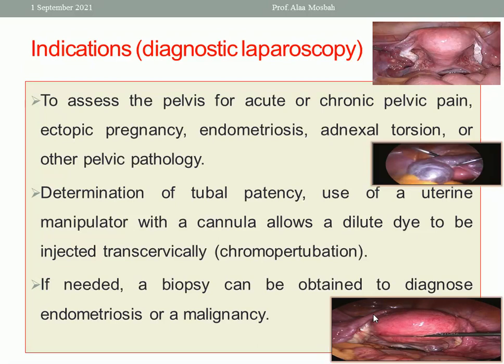During diagnostic laparoscopy also, I can take biopsy to confirm the diagnosis of endometriosis or from suspicious mass in the ovary or fallopian tube for histopathological evaluation to exclude malignancy.